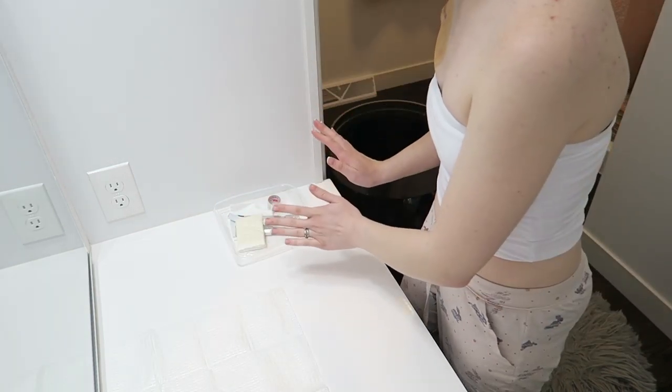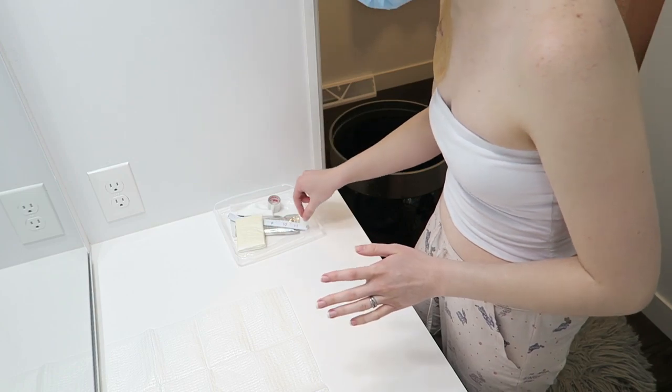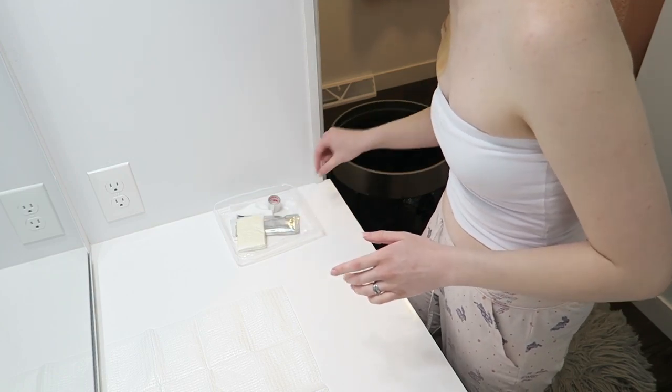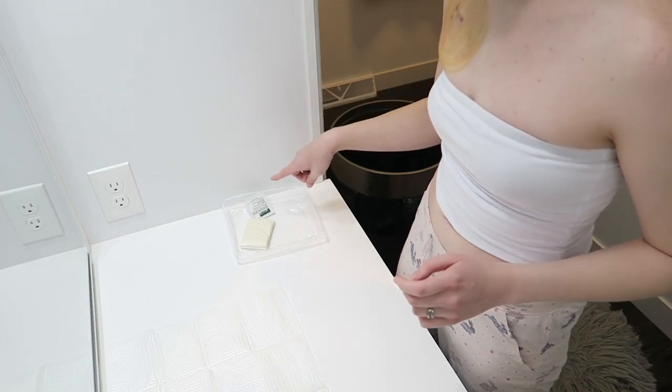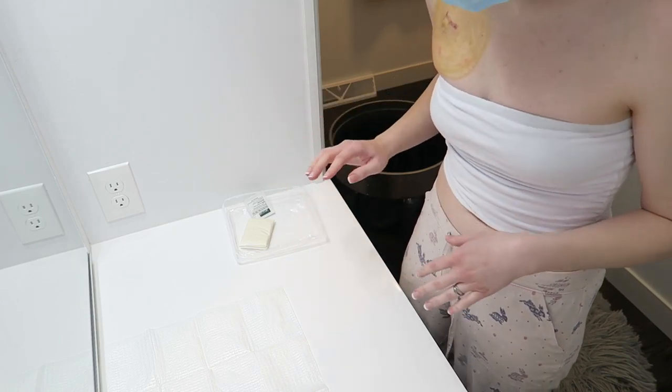Next thing, I'm gonna leave everything else in here. I actually don't need this stuff. Technically, I could throw it away because I don't use it. I do use the skin barrier thing, but I don't use it until after I'm no longer sterile.